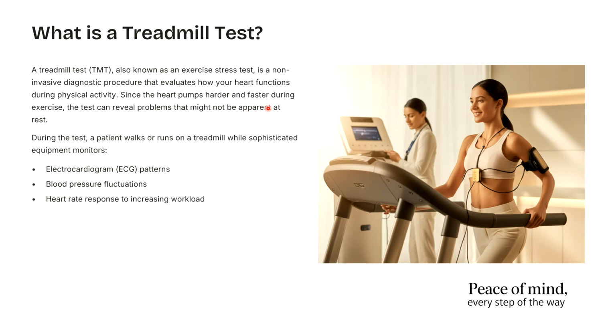Since the heart pumps harder and faster during exercise, the test can reveal problems that might not appear at rest. For example, the heart of a patient may be weak, but because he or she is doing regular activities, it is not possible for anybody, or for the patient himself or herself, to identify that the condition of the heart is not good.